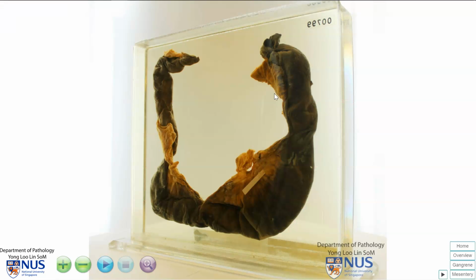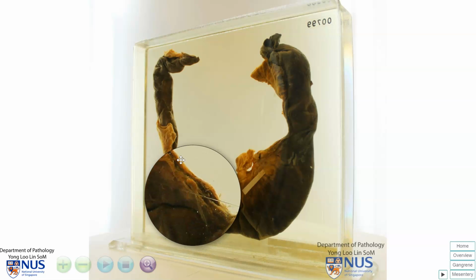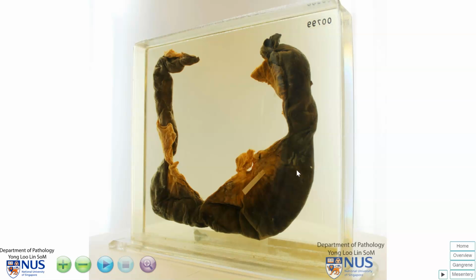Hence, in summary, this is a case of strangulation of the small bowel, where you can see this blackish, dusky discoloration of the bowel wall, as well as markedly congested vessels in the mesentery. Microscopically, there is marked hemorrhage and congestion as well as edema, and eventually this can give rise to hemorrhagic necrosis, perforation, and peritonitis.